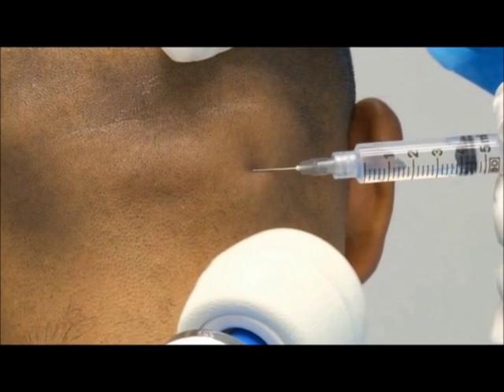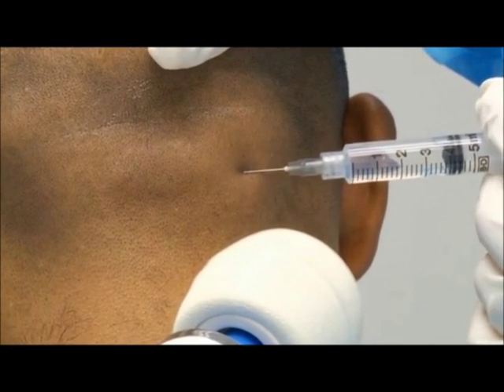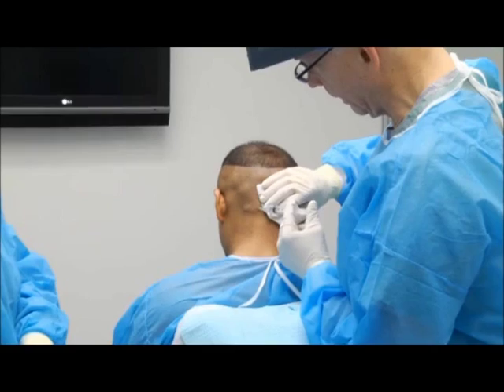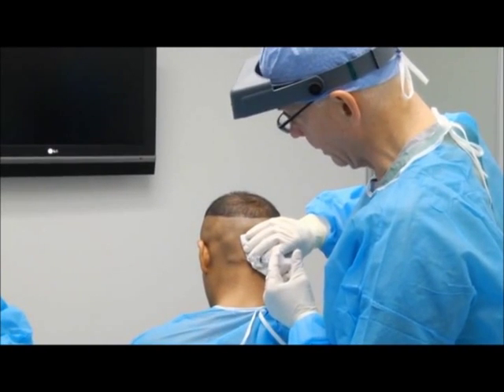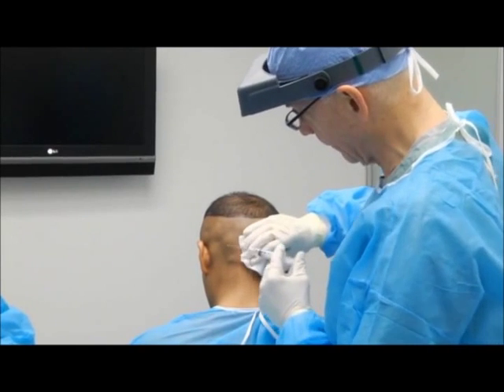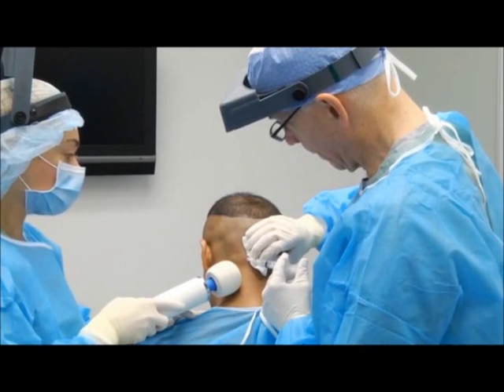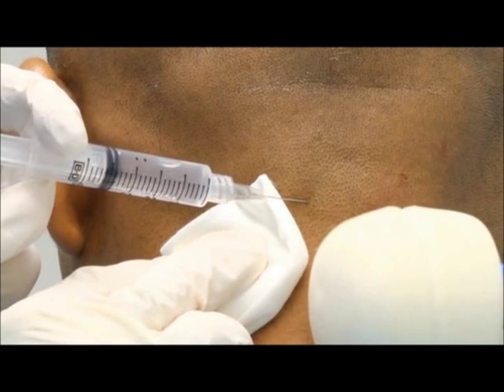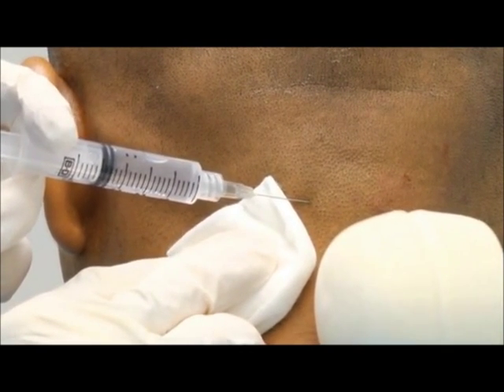This is the level we usually go. What we do is keep advancing the needle into an area that has prior anesthesia, so it will be partially numb, and then we advance around the total perimeter of the scalp. The vibration gates the sensation of pain to make it a little bit more comfortable for the patient.